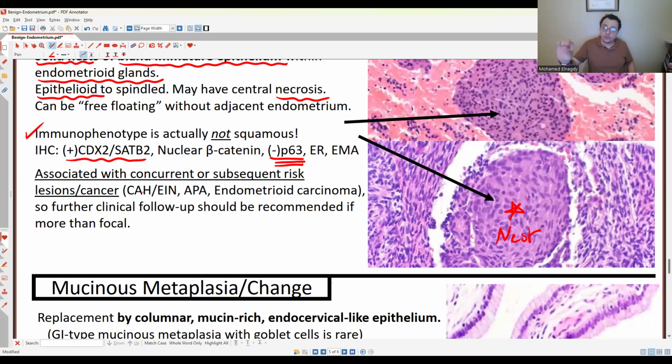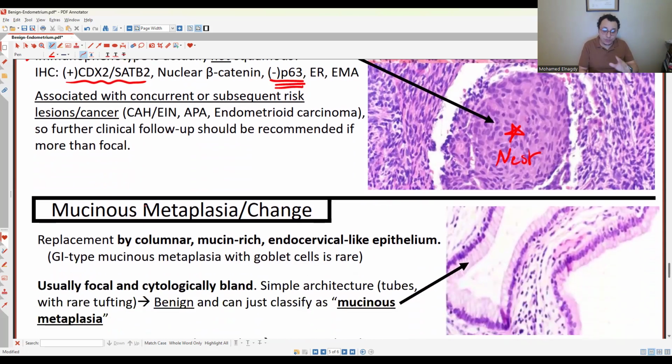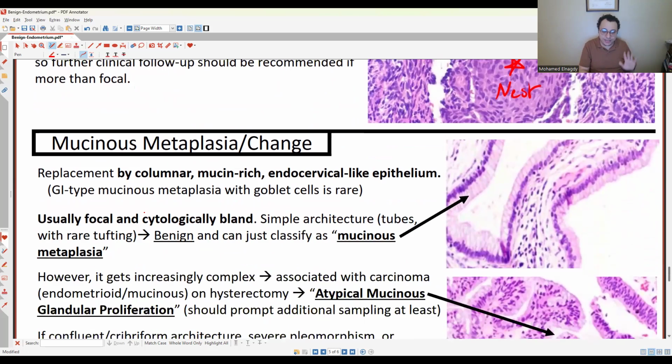And then in the note you say that this squamous metaplasia of endometrial gland could be a sign of concurrent or subsequent risk of cancer. You are telling them that you might have biopsied the wrong location and there might be a cancer somewhere else, or this patient is going to go over to cancer at any time. So just consult with her. Maybe she would rather remove the whole thing and just take this headache off.